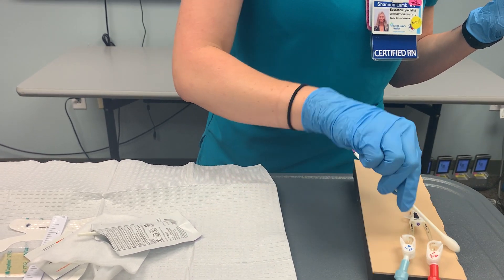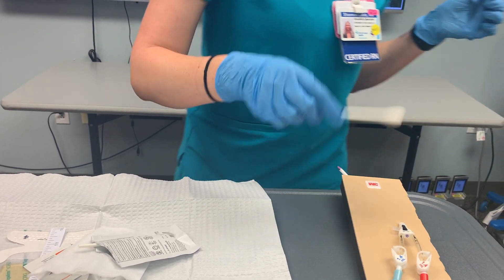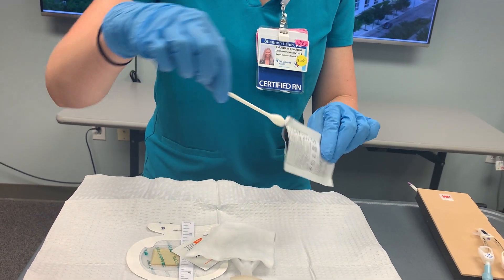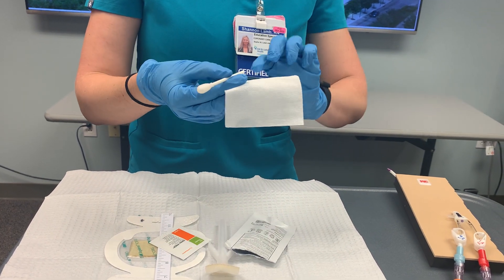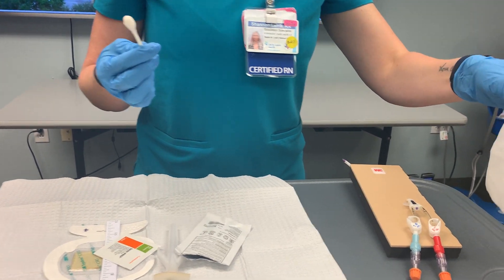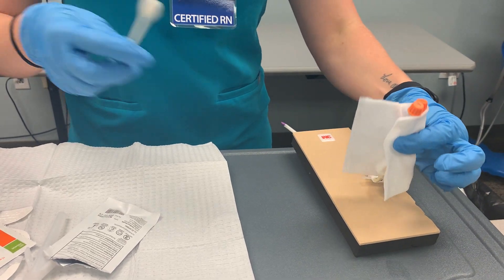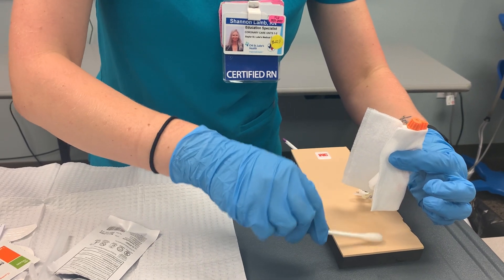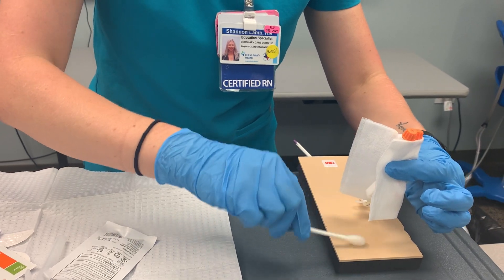Again, 15 seconds of scrubbing, ensuring that my sterile gloves aren't touching anything that is not sterile. I'll use my last stick to clean underneath the lumens. I'm going to get my stick ready and also utilize my 4x4. The 4x4 is sterile and you're sterile, but the outside of the lines is not sterile. So we throw this 4x4 over the top to maintain our sterility, pick up the lines, and then we have the ability to clean all underneath and remove any material we don't want under our dressing in a sterile and safe manner for the patient.